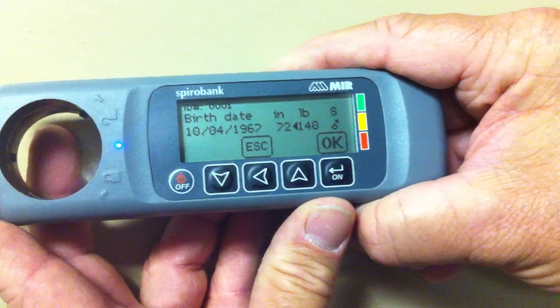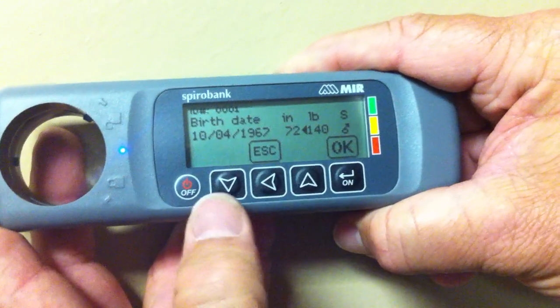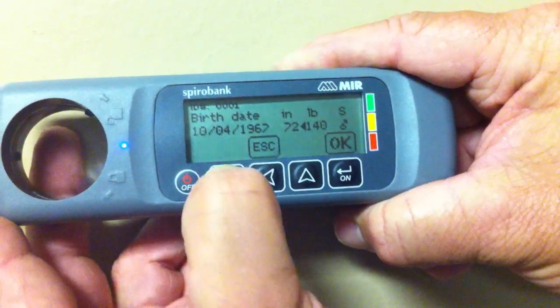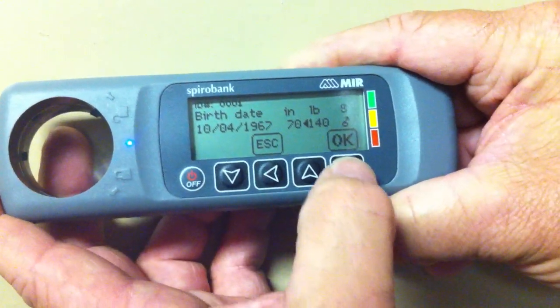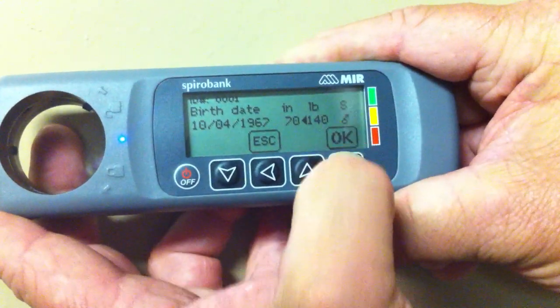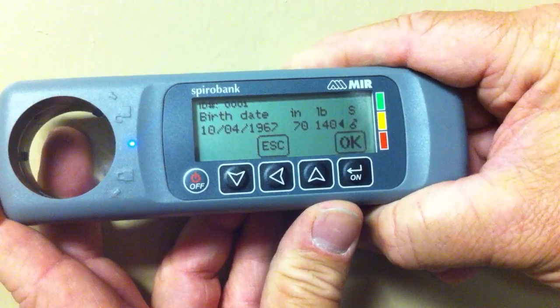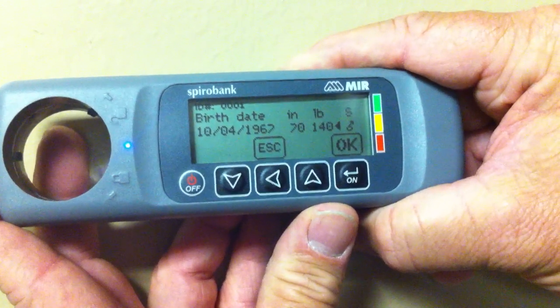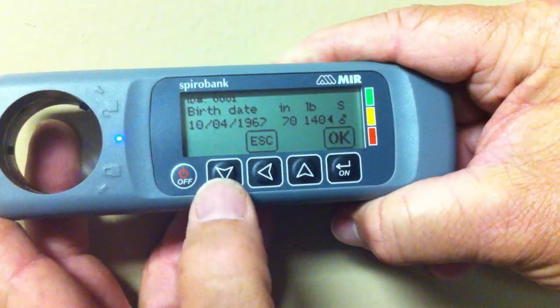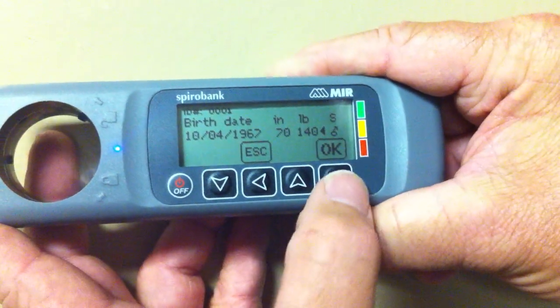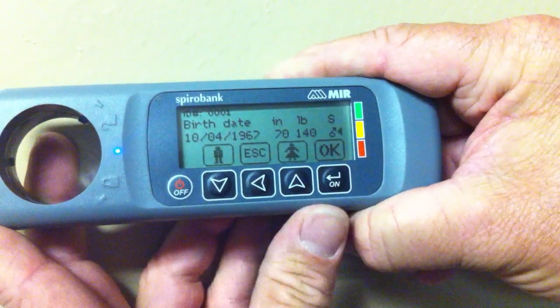Enter the height in inches using the up and down keys, then hit OK. Enter the pounds in weight of the patient using the up and down keys, then hit OK.